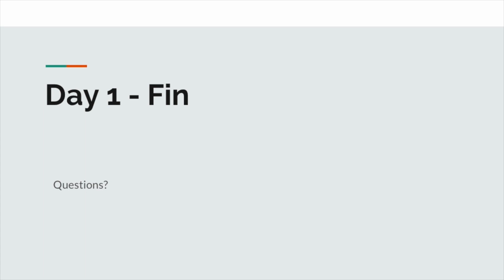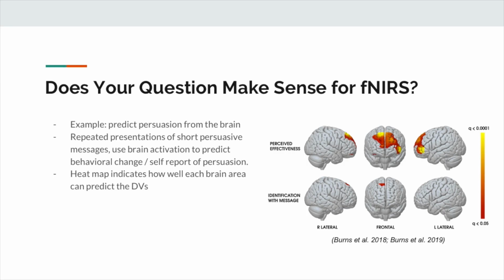Yeah, definitely. I have a question about the visualizations. Can you go back to the slide with your figures from your papers? Yes. So, I don't know if this is just me, but compared to fMRI images, it looks like it's more linear, like it's more cut off on the left hand side. Is that just because of the difference in spatial resolution?